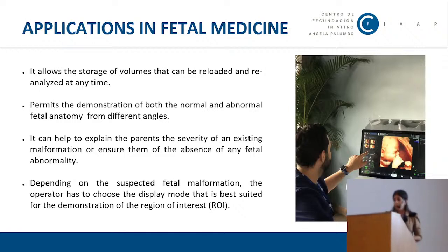When counseling the parents, the rendered images can help them understand the severity of an existing malformation, or on the contrary, reassure them of the absence of fetal abnormalities. And of course, depending on the suspected fetal malformation, the operator has to choose the display mode that is best suited for the demonstration of the region of interest.